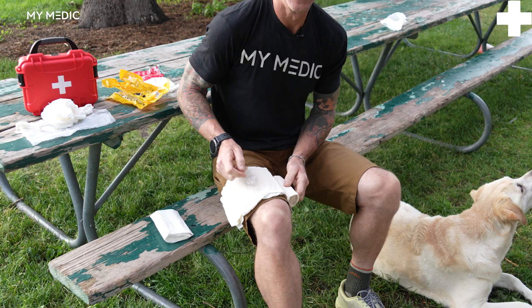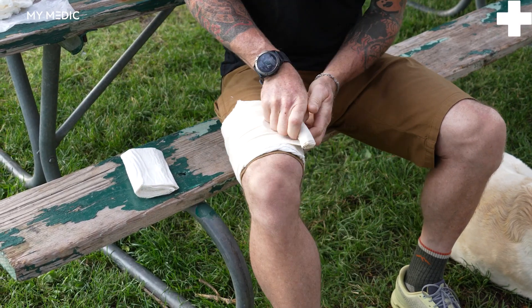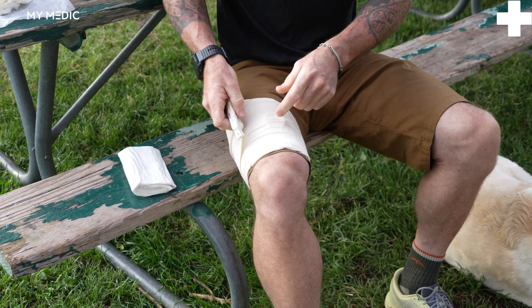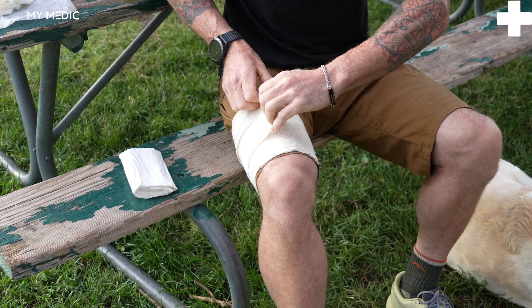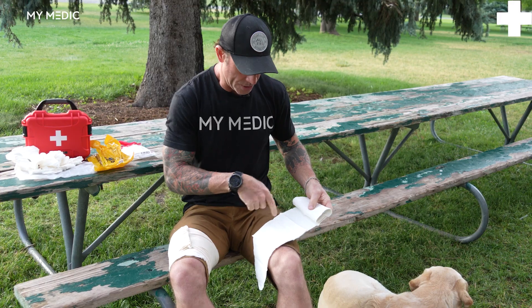I'm going to start by applying the Olias to my right leg. You're going to stretch and wrap to get that nice tight pressure dressing, with that little piece of plastic staying over the top of the wound. Hook it in and you're good to go.